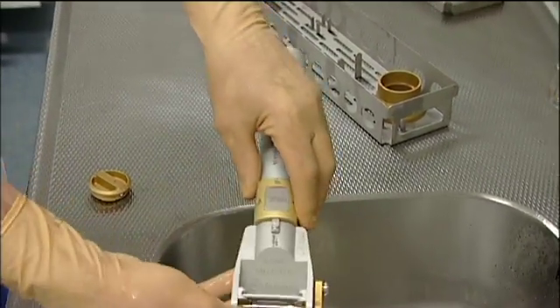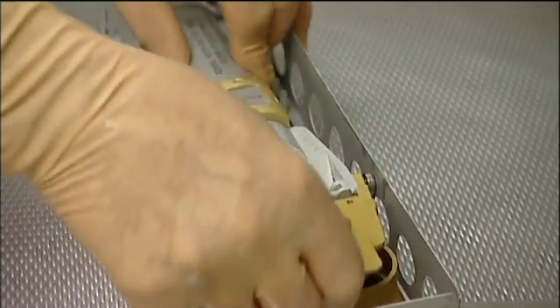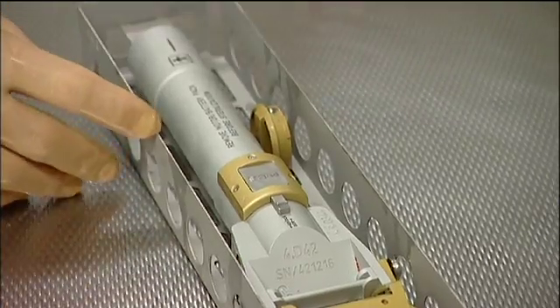For washing and sterilizing, the dermatome is placed in an autoclave case that can only hold the instrument after removal of motor and battery, thus preventing accidental sterilization of these parts.